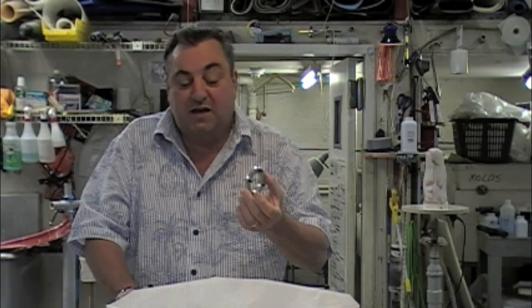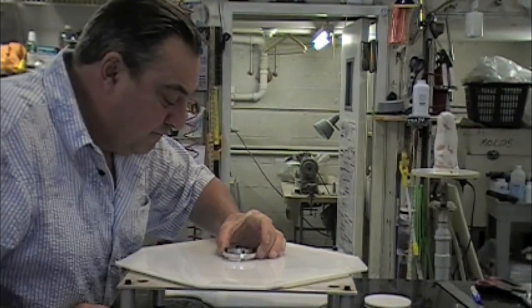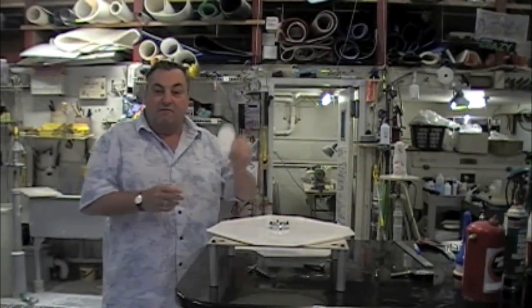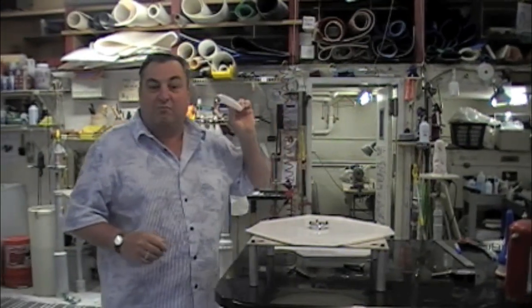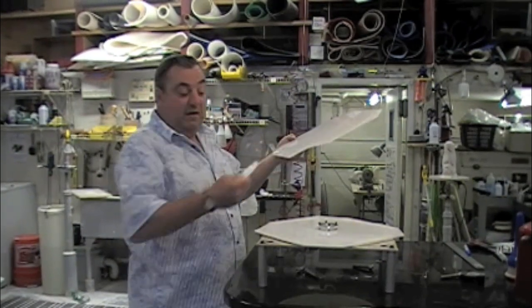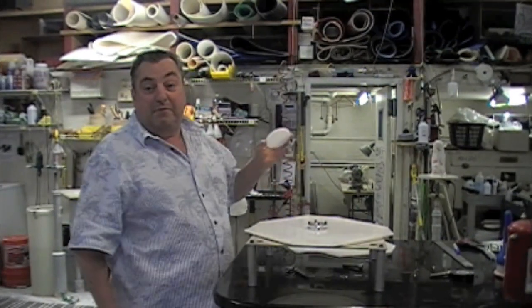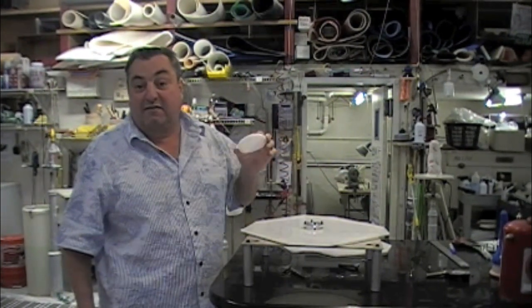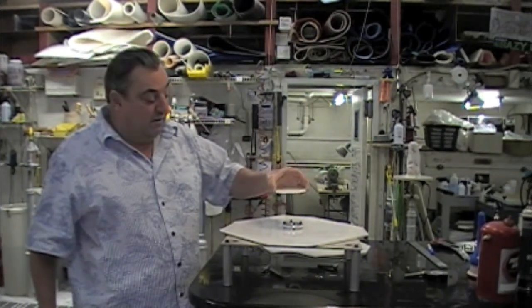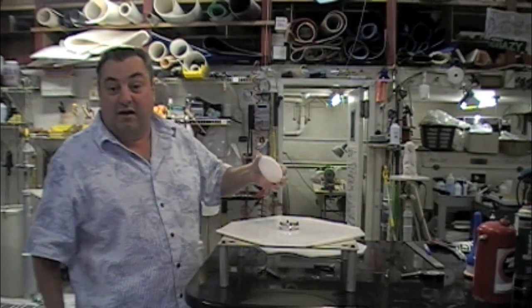We're going to do this all upside down, so we place the screws upside down and center the plate over that hole. Then the next piece is a round disc of co-polymer — cut right out of the corner of one of these pieces. The reason for this round disc is to double up the thickness in the region where the plate's going to be, so the screws have something to insert into and it gives a better base of support. It's going to be a half inch against the model and another quarter inch on the outside of the plate.